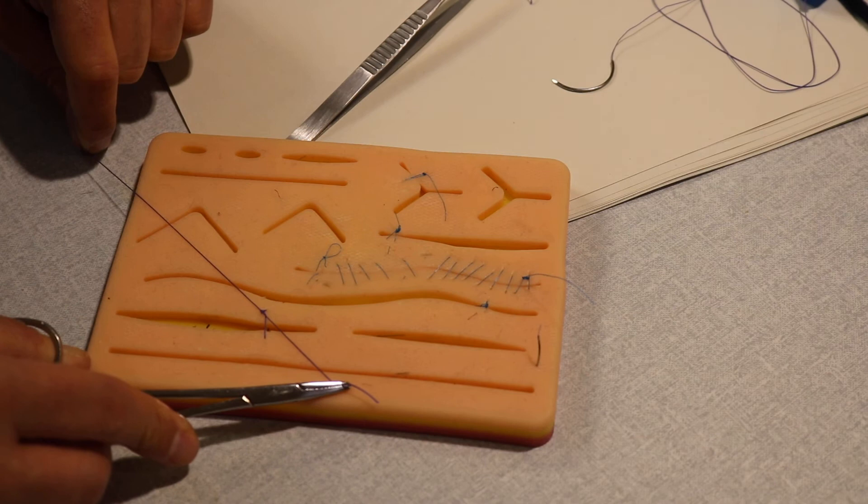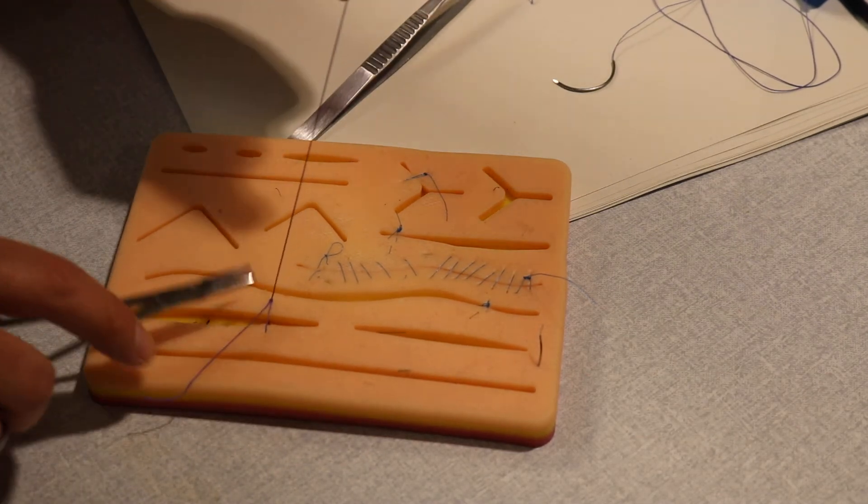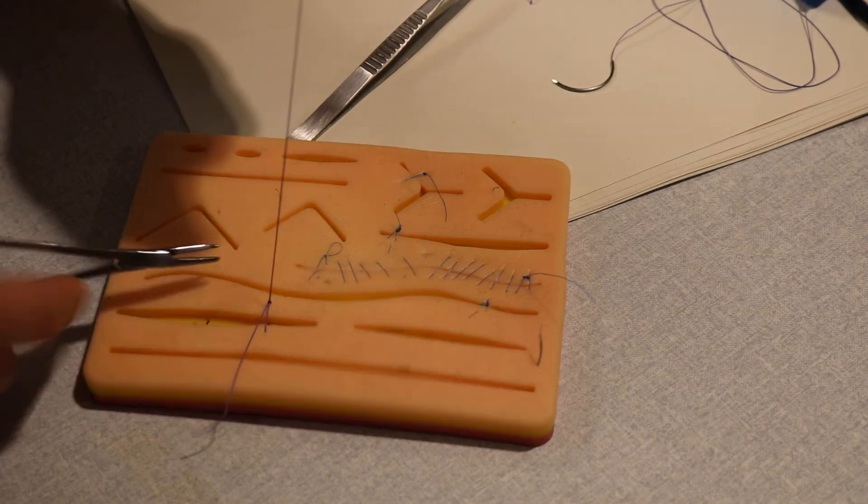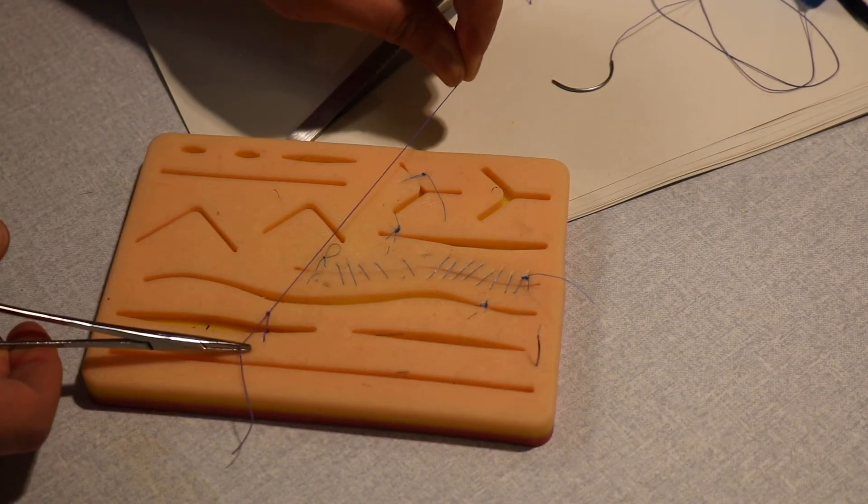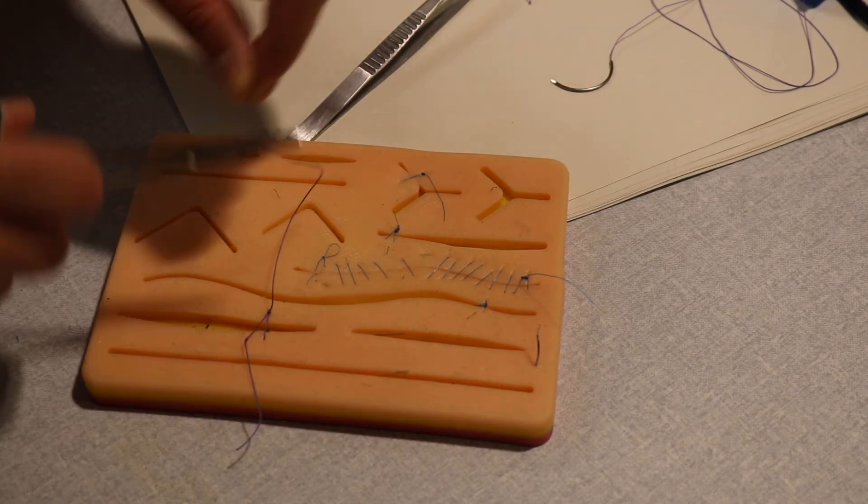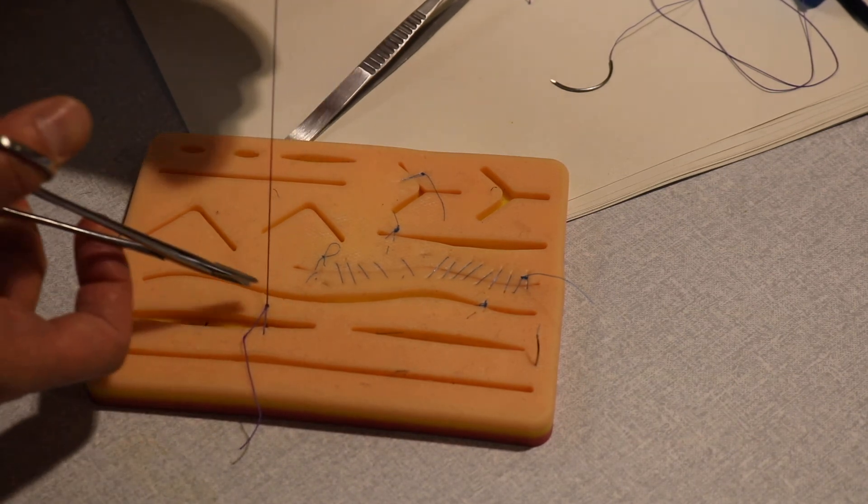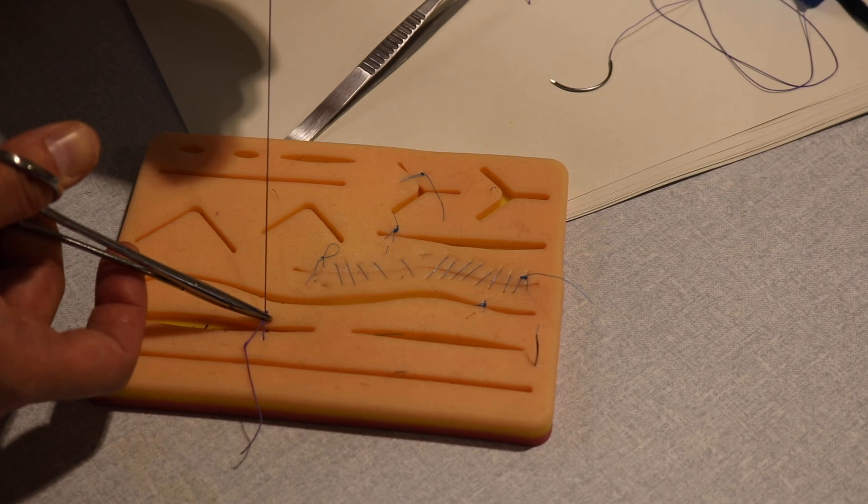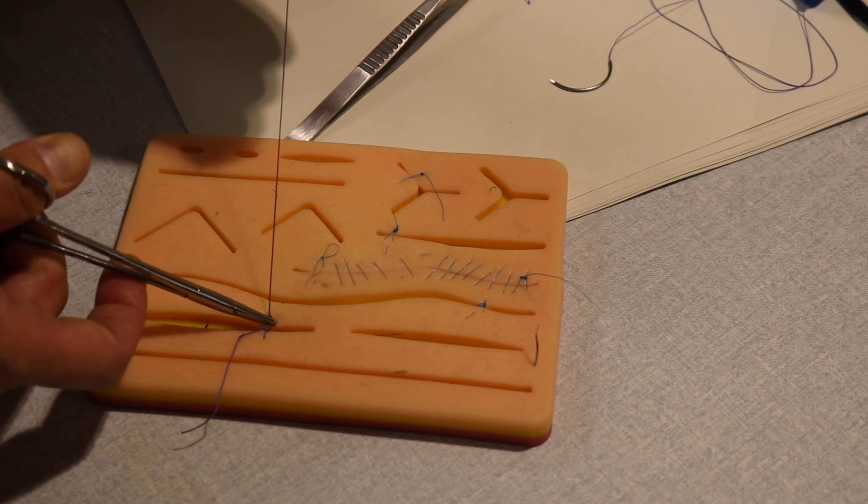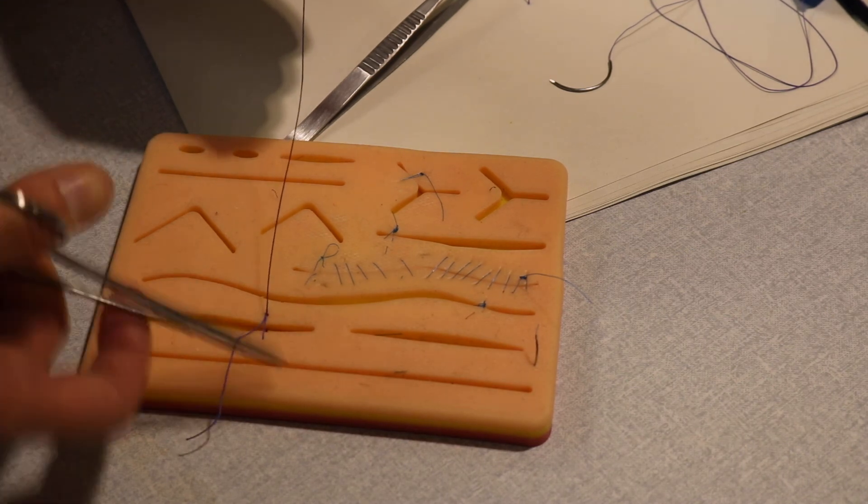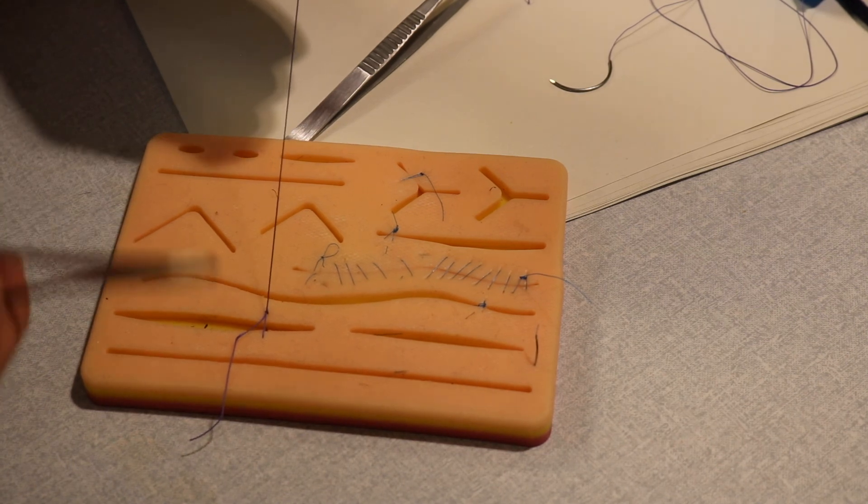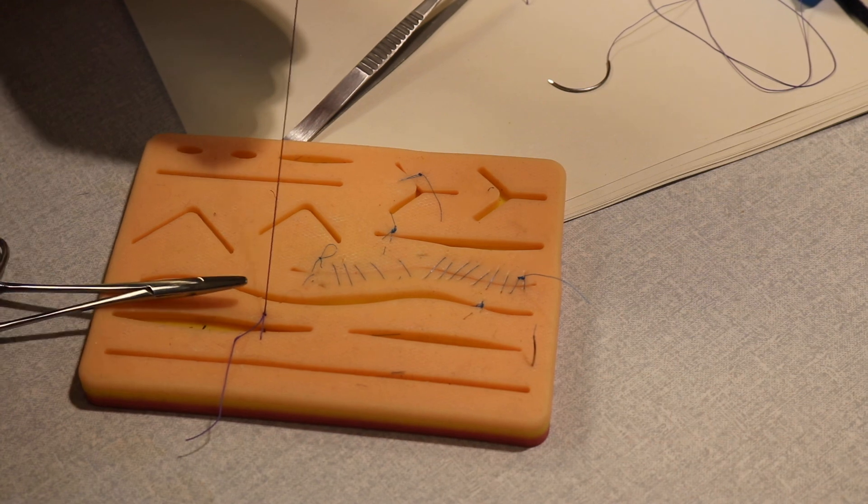So that's not coming still, so you might need to slip it or something. That would be a slip knot, but it's not slipping because it's a reef, it's very secure. These are the things: you can do two or three actually to hold it in place. Sometimes some people can hold it for you with a clip, hold the knot for you, but not tighten a lot because you'll fracture the stitch really. To hold it when something is gaping like this. These are some of the pitfalls and things that can happen.